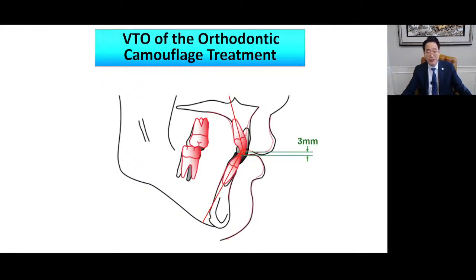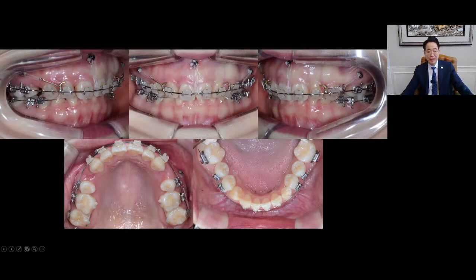When intruding upper anterior teeth, they should be located 3 mm below the stomion. The intrusion of upper posterior teeth would also be required to accomplish an adequate upper occlusal plane, 100 degrees to the true vertical plane. For intrusion and palatal root movement of upper incisors and intrusion of upper molars, 3 TADs were placed.